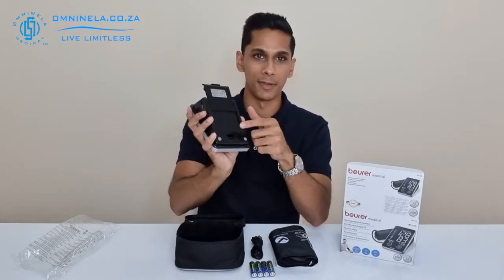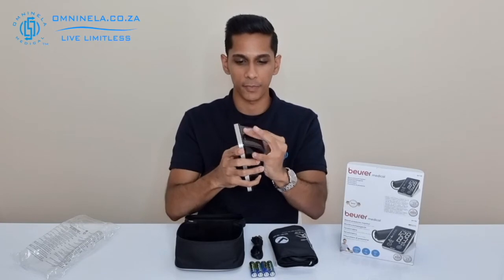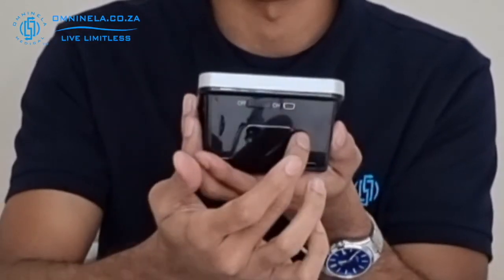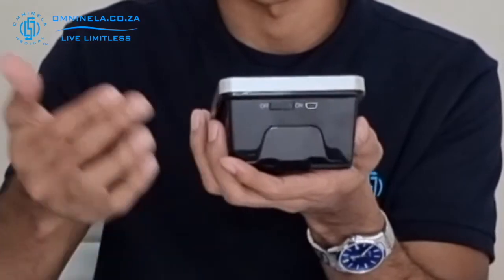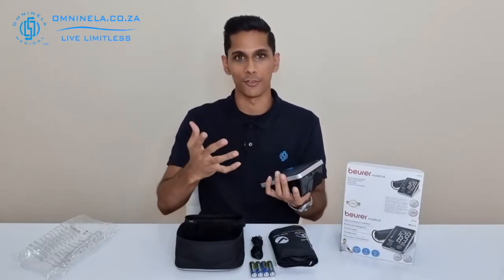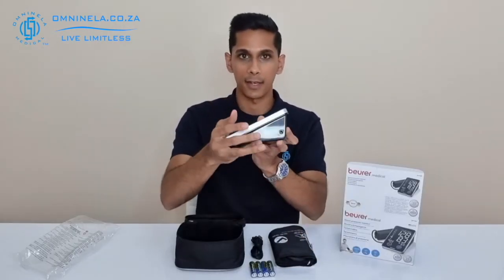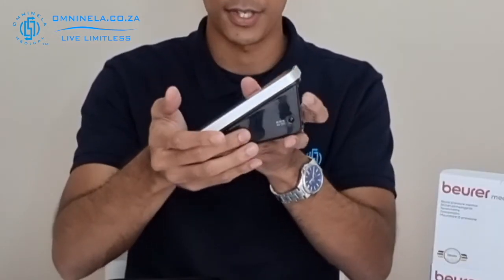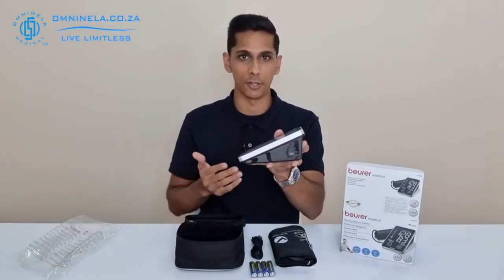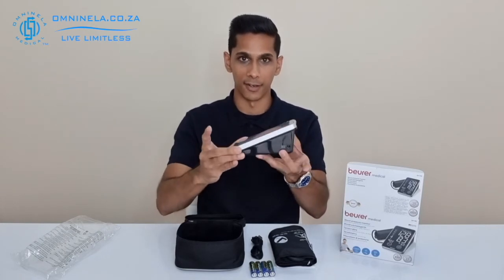Underneath the cuff holder is your battery compartment — that's where your four double-A batteries go. On the back side you've got your USB input and also your power on/off switch to power the device on and off whenever you need to use it. On one side you've got your tube input which connects directly into the device, and on the other side there's a DC input, so if you have a DC cable running to a two-pin power supply you can use that directly.